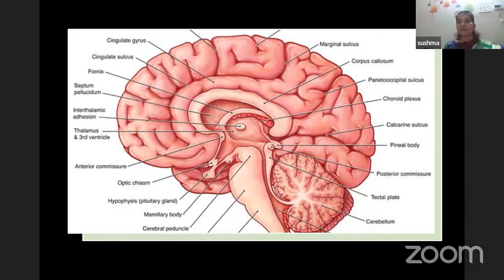When you plan to do an anomaly scan in a fetus, if you look at the three axial sections, that is transcerebellar, transthalamic, and transventricular, that is enough to rule out abnormalities in the fetal brain. Now, if you want to do a detailed fetal neurosonogram, then we can go on and do the mid-sagittal section, lateral sagittal section, and coronal sections.